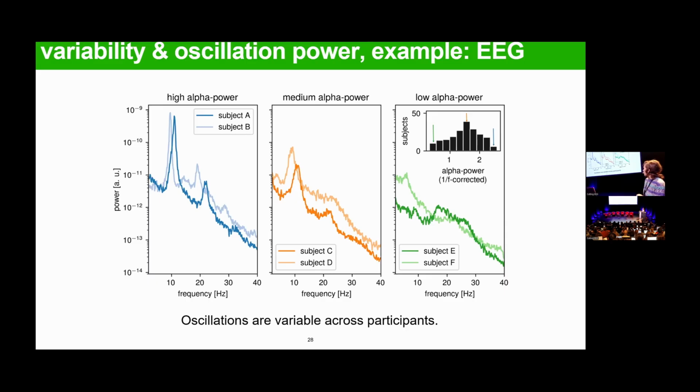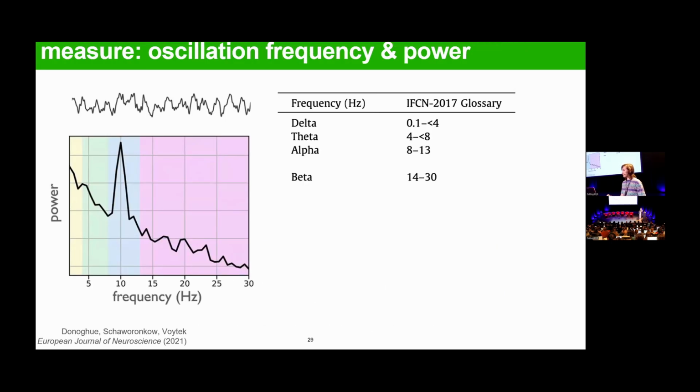So you have nothing raised at 10 hertz. From this empirical observation, the community has made a specific vocabulary to talk about what you see in spectra, based on Greek terms. People often divide spectra into canonical frequency bands: delta activity, theta activity, alpha activity, beta activity, and it continues.